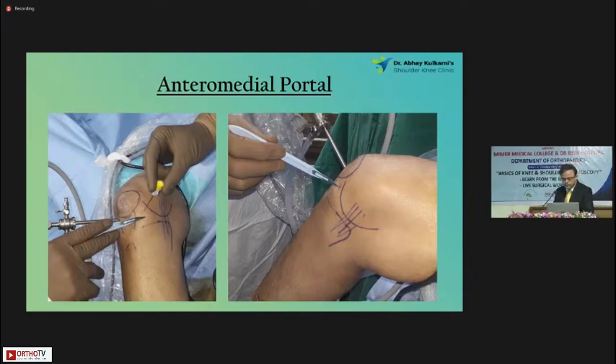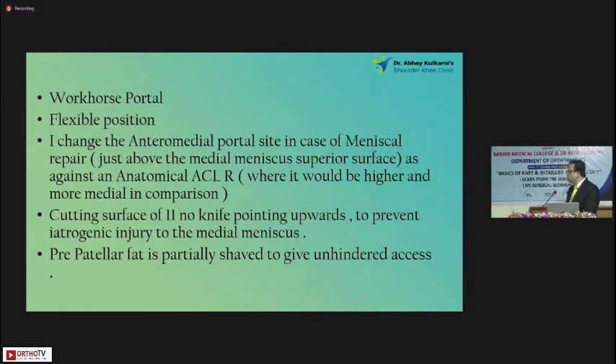That's the workhorse portal — most of you would be working through that portal. Be flexible and try to change it. The anteromedial portal can be changed according to the surgery you are doing. Regarding the infrapatellar fat pad, I usually do a very minor or partial shaving of the fat pad so that access through the anteromedial portal is very clear and clean. Your instrument should not get stuck up — this is another important point to be considered.